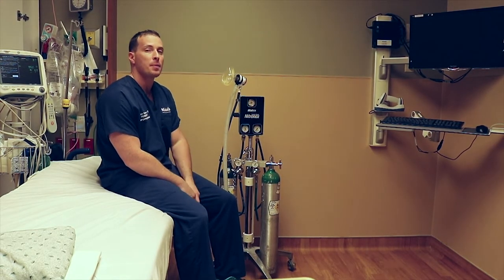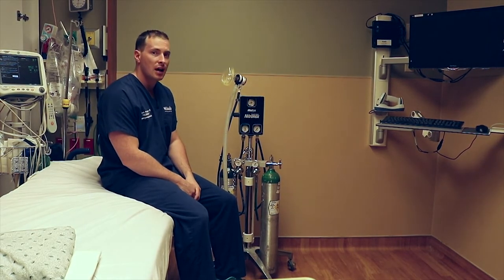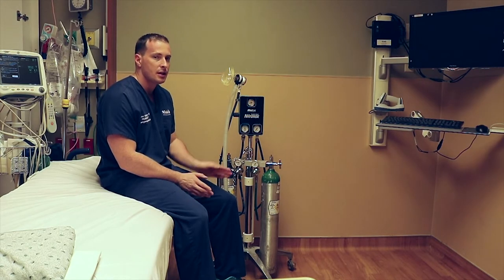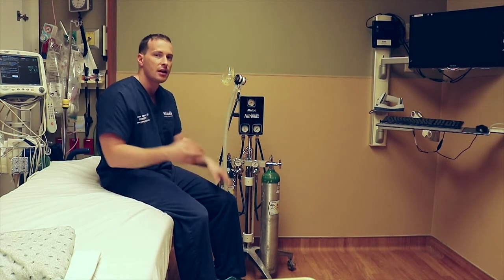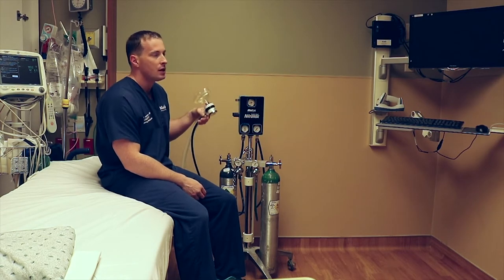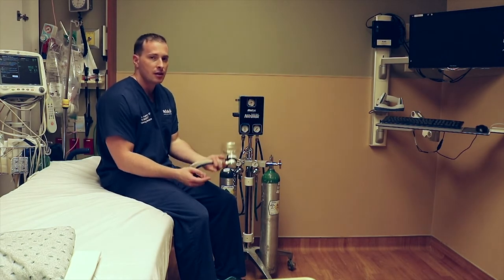All right everybody, this is Dr. Kapper and today we're going to teach you about the Nitronox Nitrous Oxide Delivery System. This is a way to administer a mixture of nitrous oxide and oxygen, typically between 70/30 and 50/50 percent.